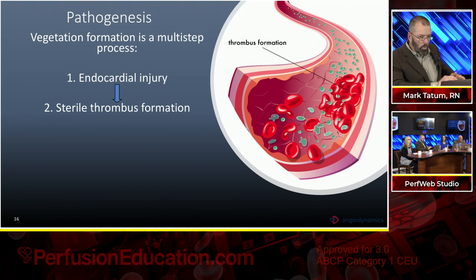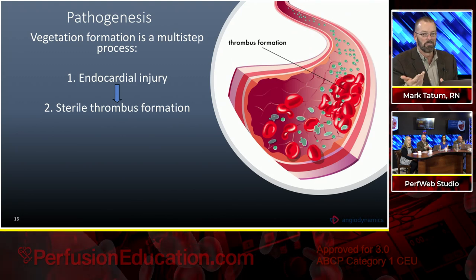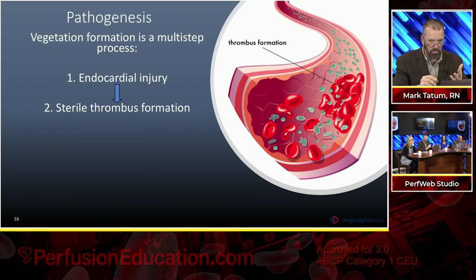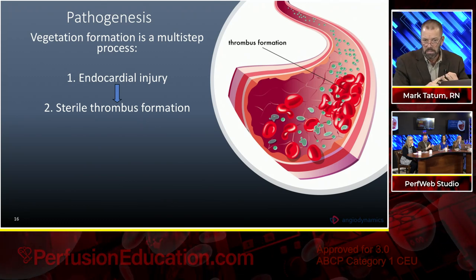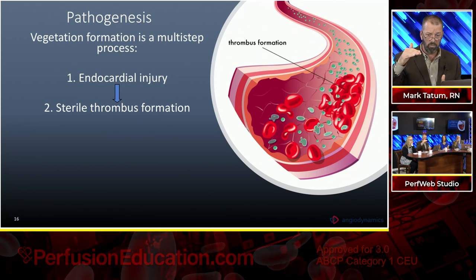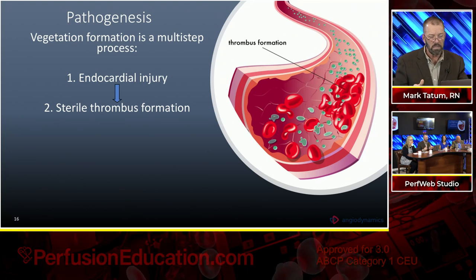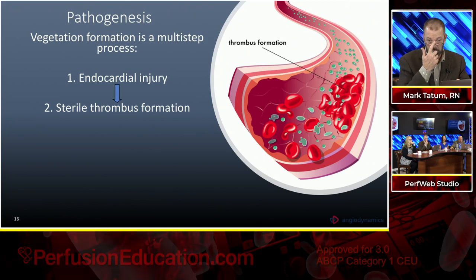So if we're approved for fresh or soft thrombi or emboli, how can I possibly be up here talking about vegetation? And the reason is because of this sterile thrombus formation. When vegetations begin, as you guys likely know, they start out as a nidus of platelets and fibrin, which is the base makeup of clot in the venous system. Having the ability to consider this on label, and really everything up to the pulmonic valve to be considered on label, allows us to treat this in an on-label fashion so that we don't have the same constraints and the same issues that you may have when somebody's trying to use a device outside the scope of the indication. Next click, please.